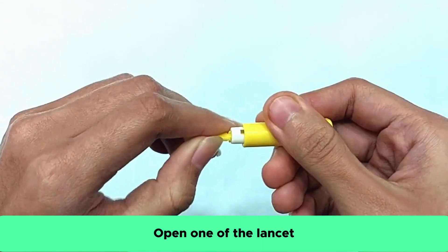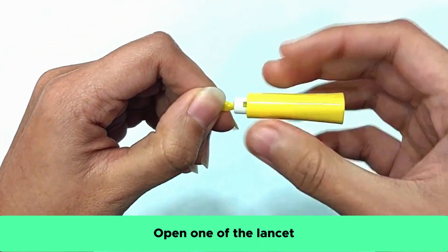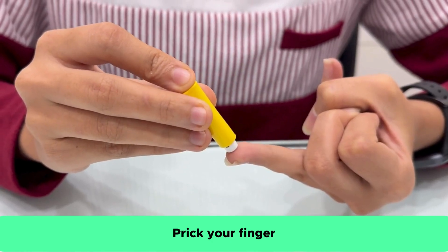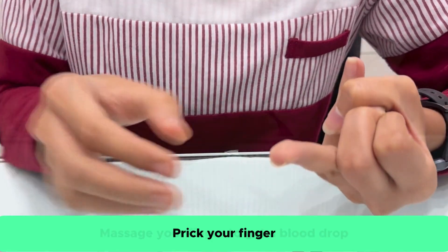Take one of the lancets. To open it, spin the cap multiple times until it loosens. Place the lancet on the side of your finger and press down firmly until you hear a click.